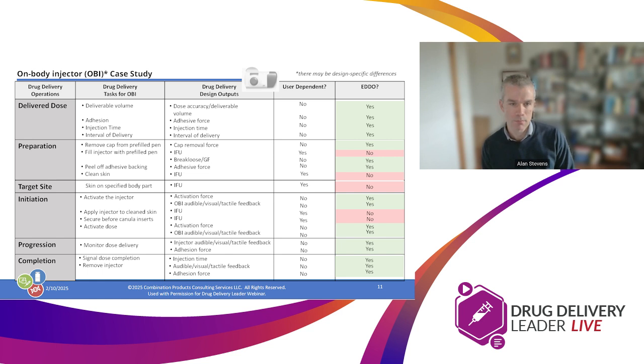Do they activate the injector? You've got to apply it. There might be some time elements, depending on the design, if you have to apply it to the body before the device automates some functions, and then do you have to activate the dose? And again, some of this is going to be largely dependent on the specific design features of your product.